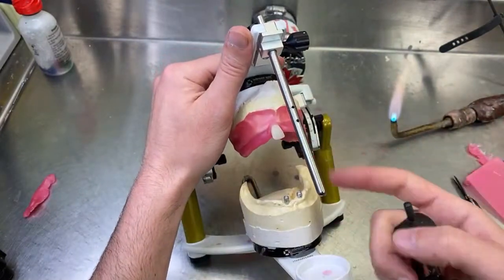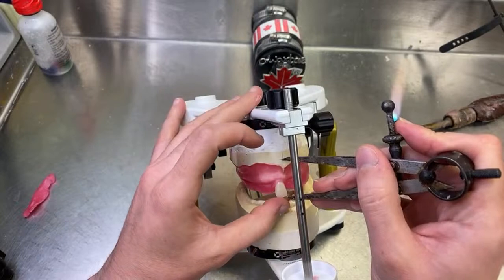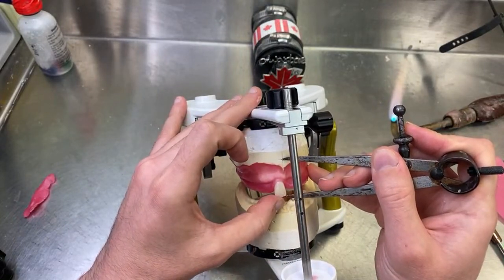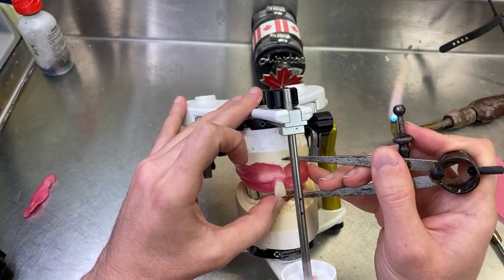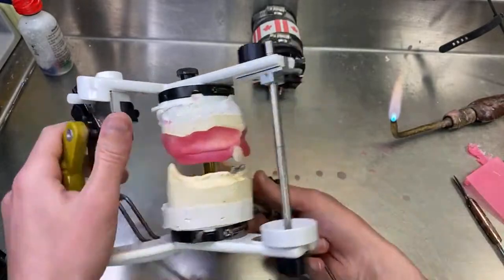Okay, so now we have the center line lined up and we have the support almost there. Now we watch for how that is gonna line up with the lower.